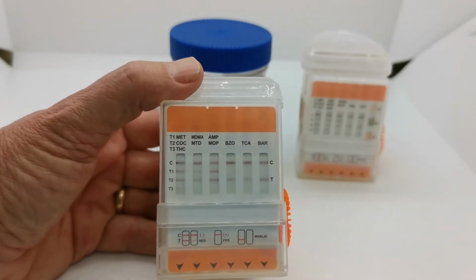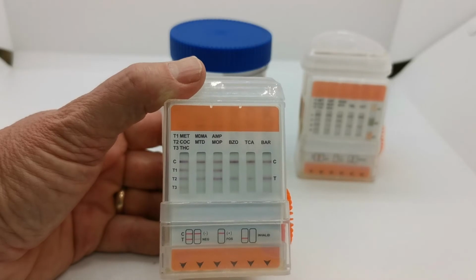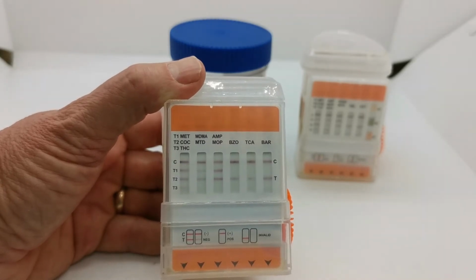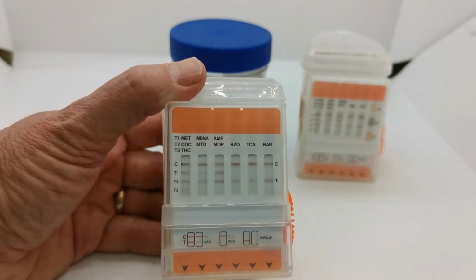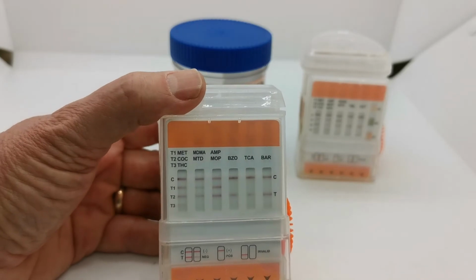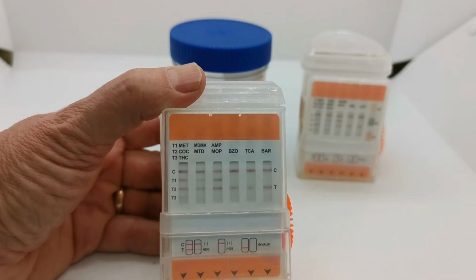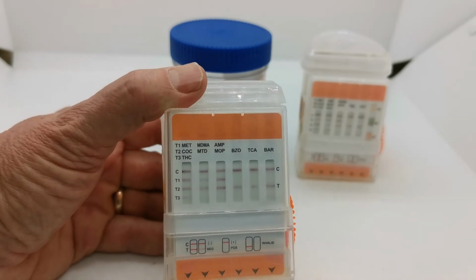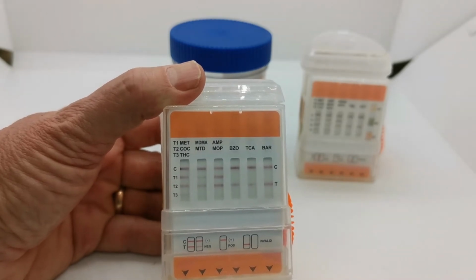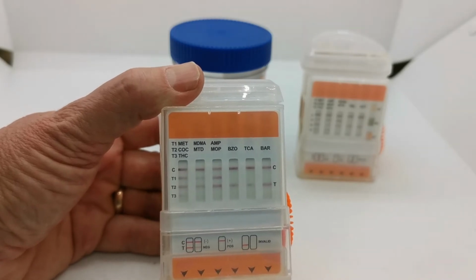The important thing to note here is that if any test line is showing at the correct read time for that test, and there is a clear control line at the same read time, then the test has to be interpreted as a clear and absolute negative result. Now that's important. Some people may try and infer from a very faint or partial test line that the drug in the urine is just at or around the cutoff level for that drug test. This cannot be inferred from a faint or partial or very thin test line.